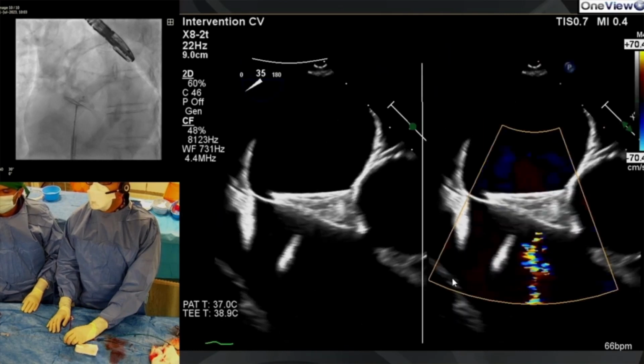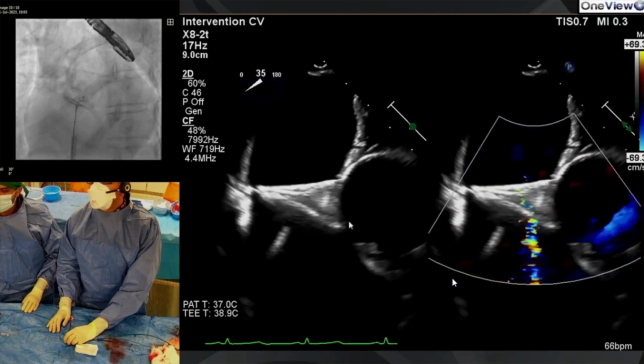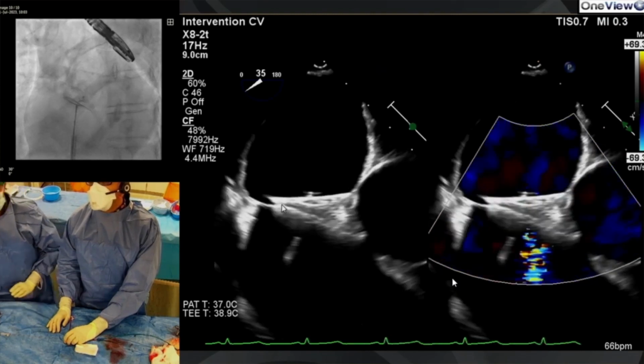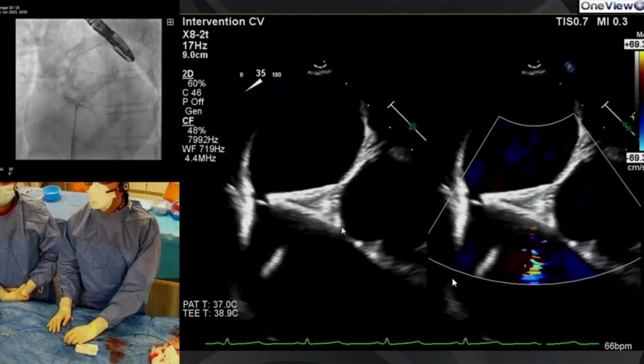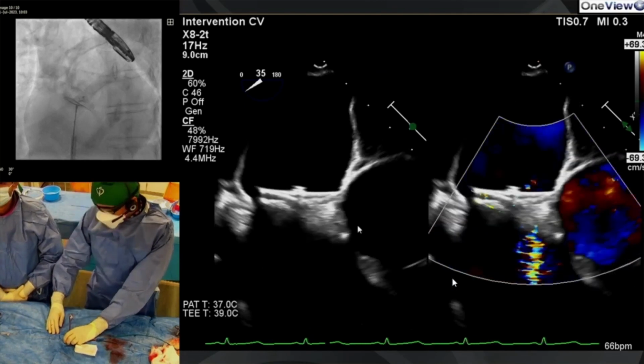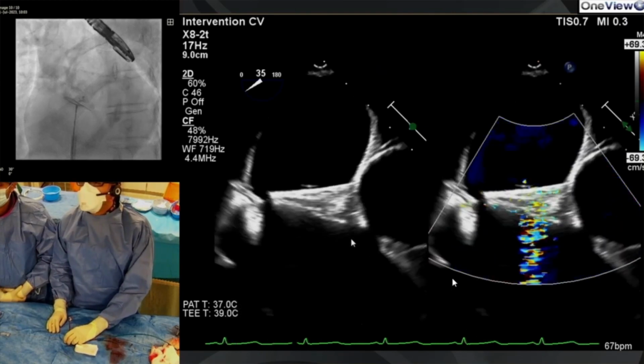I'm just going to do my color compare and go around. And you can see here, again, the point about the aorta. This is why we wanted as small a disc as possible. This is the 18 device, and any bigger would have ended up... Sorry, 25. This is 25, is it? Okay, good. Yeah, and it's just about right. Any bigger, we would have run into trouble there.